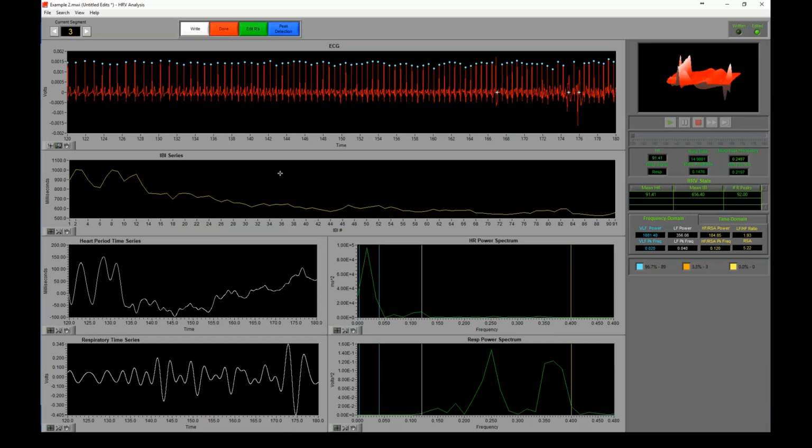But a complex waveform, such as an ECG or an IBI series, is essentially the summation of many sine waves of varying frequencies and varying amplitudes. And that's going to change on a segment by segment basis. It's going to change on a subject by subject basis. And that is basically what we're quantifying, is the presence of certain frequencies in this waveform and their magnitude.